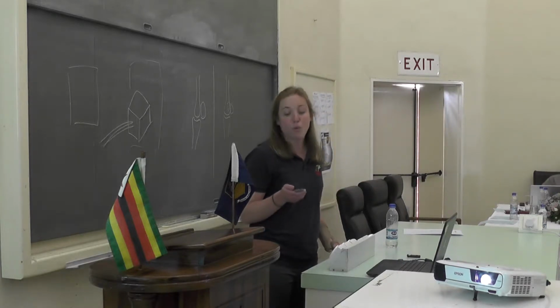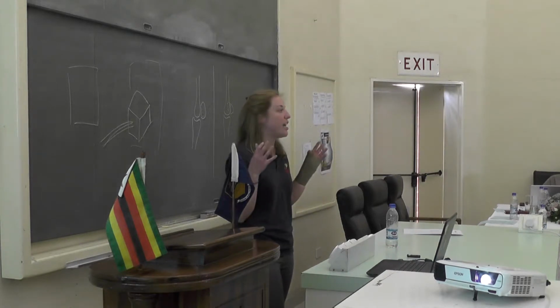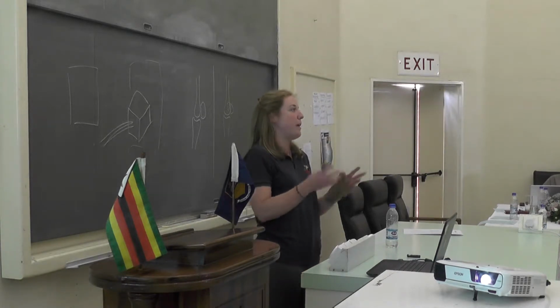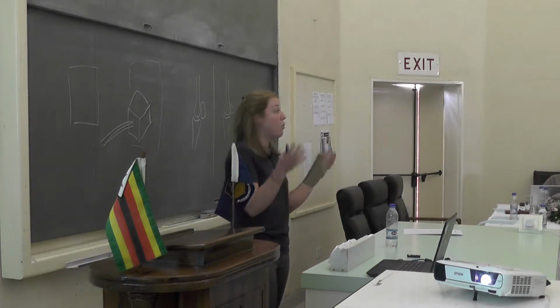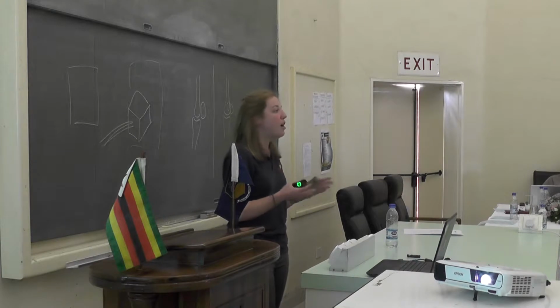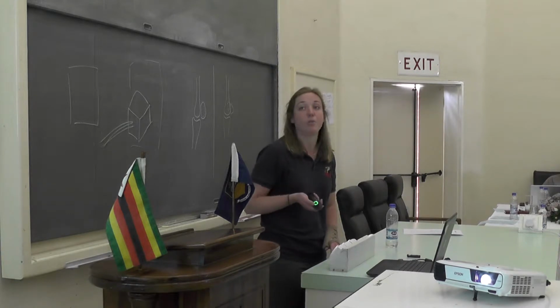You need to make sure that the distances are correct. It's the same thing as a projector. If you get too close, you might overexpose your patient, you're going to diminish the size that you're actually acquiring an image of. If you get too far, you're not getting enough exposure through that, and you're going to have your collimation settings all wrong as well.